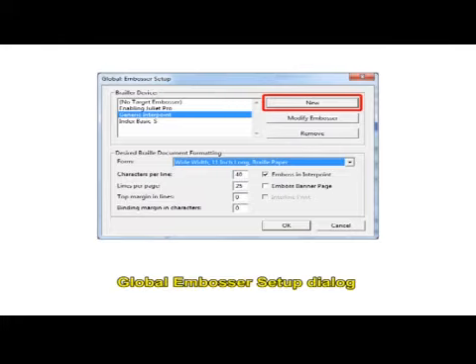General tab, which is one of the three tabs where you may begin the setup process. Modify Embosser button. Before you click this button, please ensure that you have highlighted the embosser you wish to edit in the Braille device selection list. This button will also take you to the embosser setup General tab.